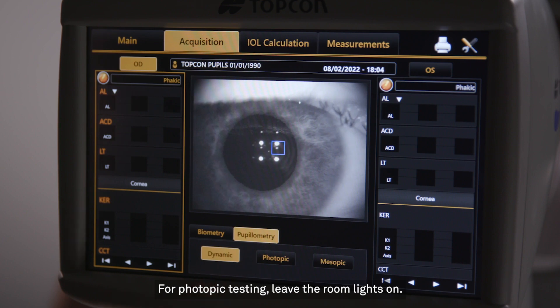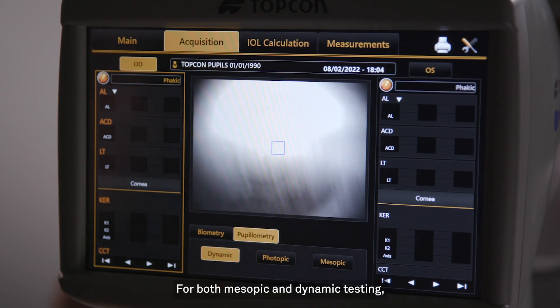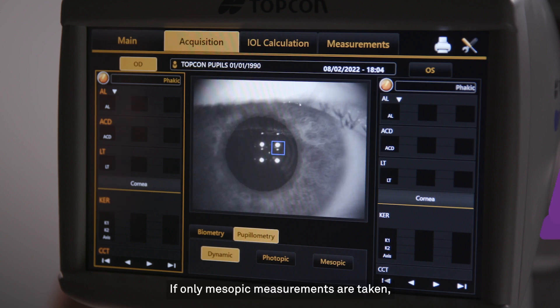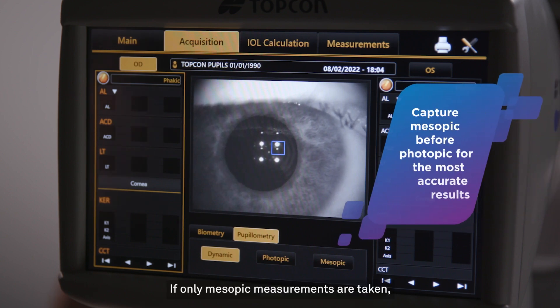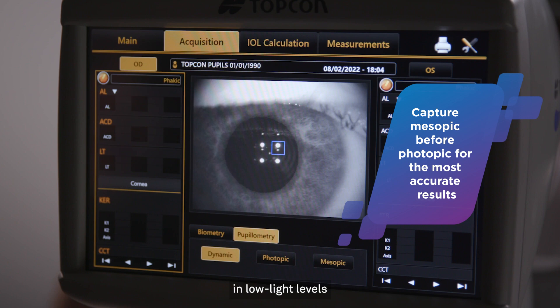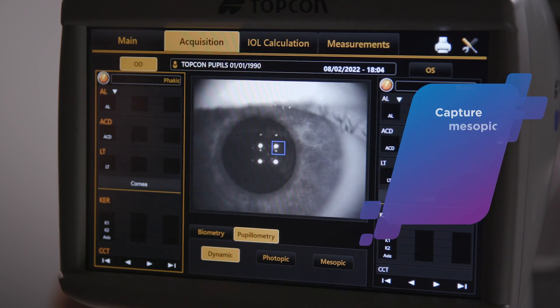For Photopic testing, leave the room lights on. For both Mesopic and Dynamic testing, turn the room lights off. If only Mesopic measurements are taken, the eye to be tested must remain in low light levels for about one to two minutes before the reading.